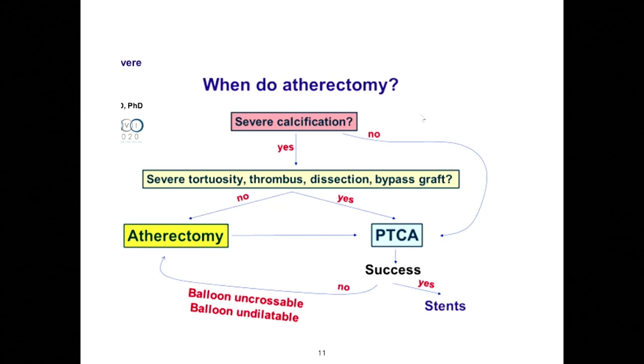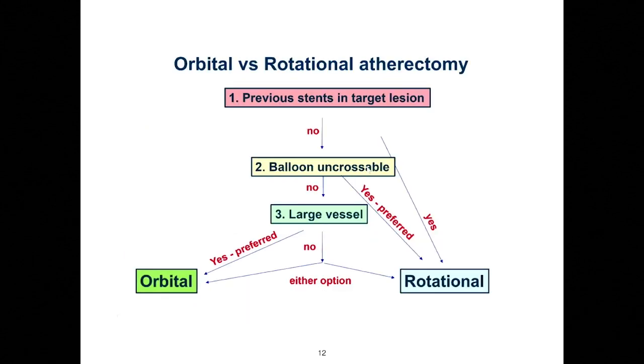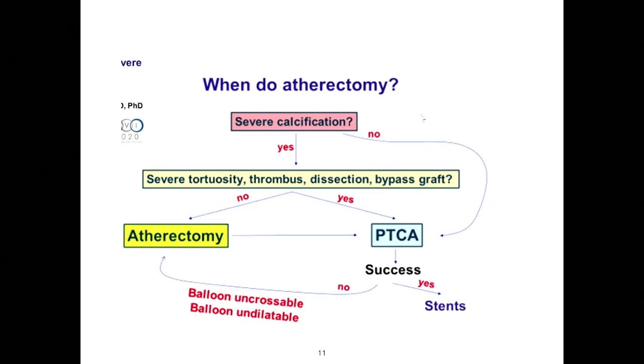The other thing is thrombus. Basically, when you're doing a rotablation, you're going to cause microthrombi going down to the distal bed. And if you have a thrombus that is there, you're more likely to cause distal clogging of the microcirculation. So even if you've done a rotablation, if the distal microcirculation is clogged, there'll be no flow going into the distal circulation, and the patient can have a real problem.